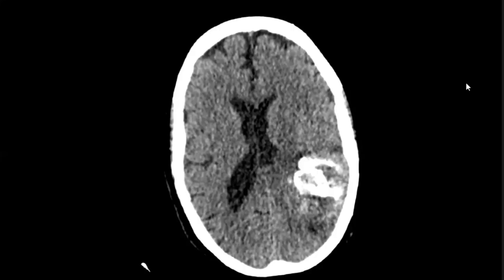What should be your differential and next investigation? Ma'am, it appears more likely an intra-axial lesion as compared to an extra-axial lesion. My differential will be any intra-axial calcified tumor, like oligodendroglioma. Second, it can be any calcified angiomatous malformation, for which I will confirm it on angiography. So what will you do first, angiography or MRI? Ma'am, for characterization, MRI, then angiography.